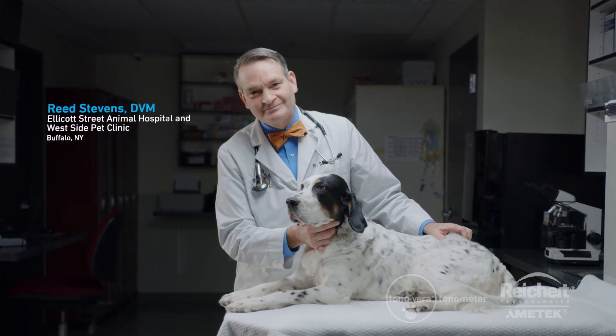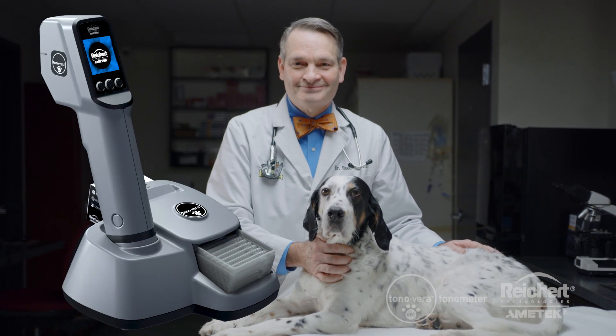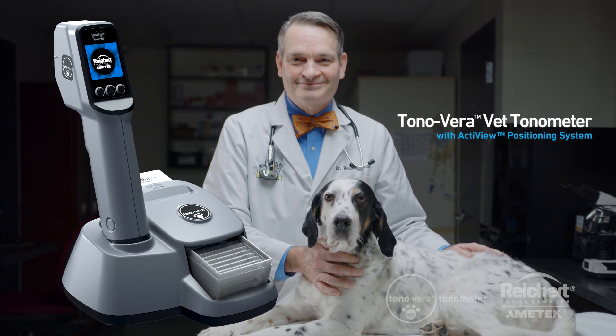Hi, I'm Dr. Reed Stevens, and I'm a practicing veterinarian in Buffalo, New York, and I'll be demonstrating the all-new Tono-Vera Vet Tonometer from Reichert Technologies.